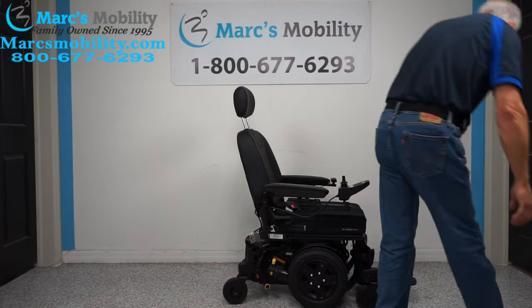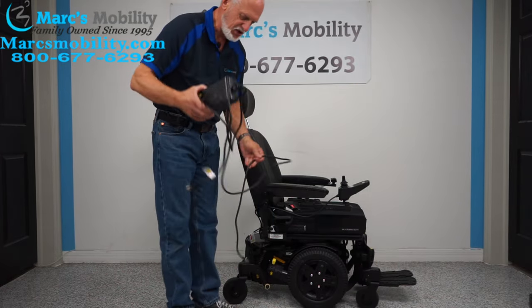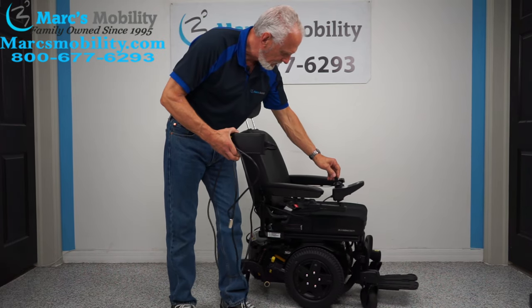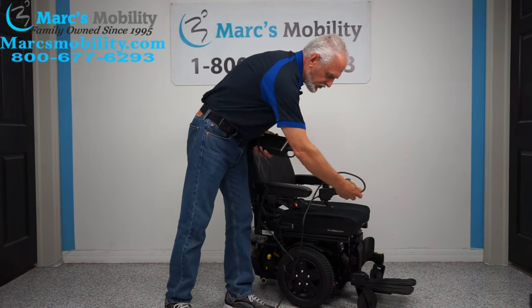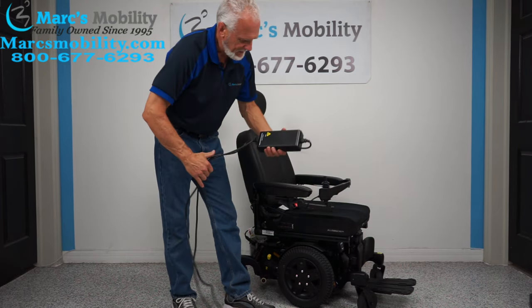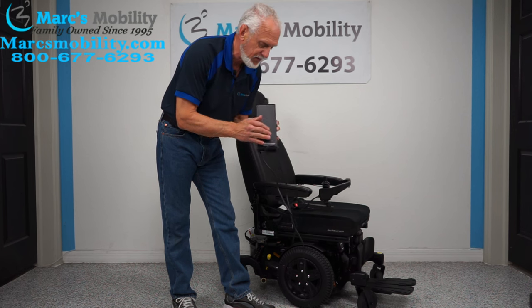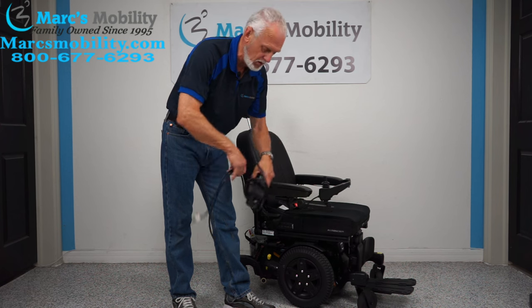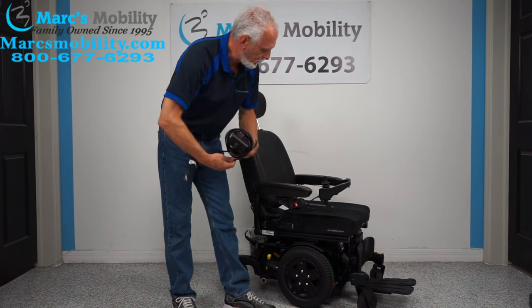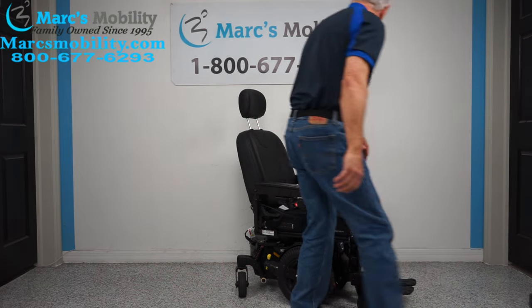When you charge this chair, you'll take the charger provided with the chair. When you charge it, you just plug your cable at the bottom of your joystick. As soon as the light on this charger goes from orange to green, you're fully charged. These chargers will stop charging automatically when the batteries are full — they are smart chargers that know how to charge and stop charging when your batteries are full.